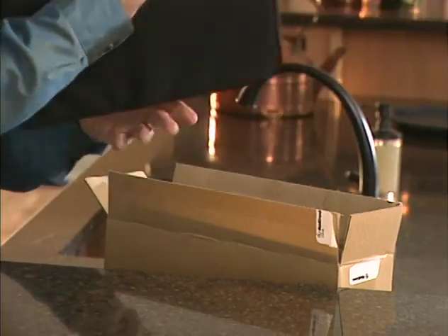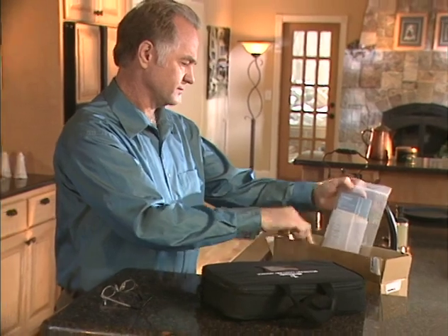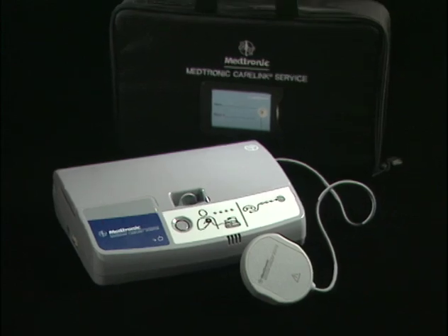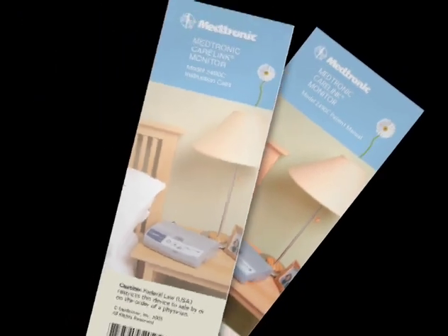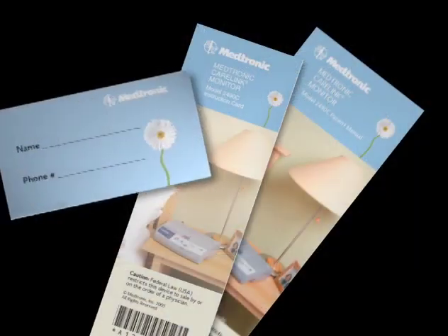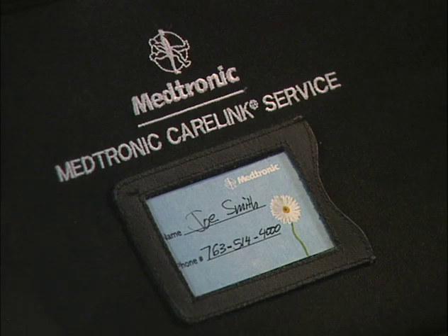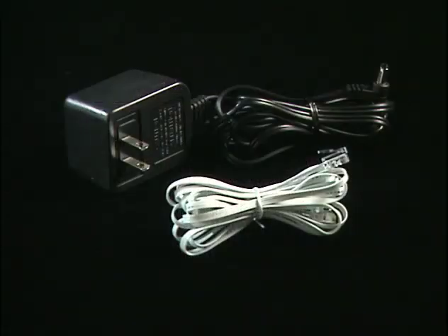Everything you need to properly operate the monitor will be delivered to your home. Along with this video, you should receive the Medtronic CareLink monitor, a handheld antenna attached to the monitor, a carrying case, a patient manual, an instruction card — which can be placed in the clear plastic window inside the compartment on the top of the carrying case — a limited warranty card, a telephone cord, and a power cord.